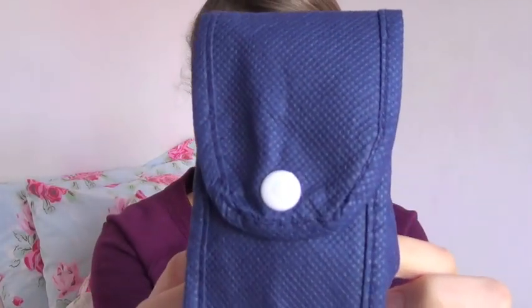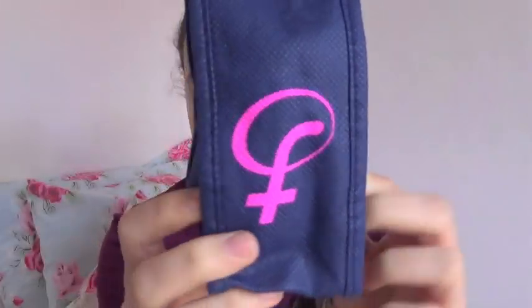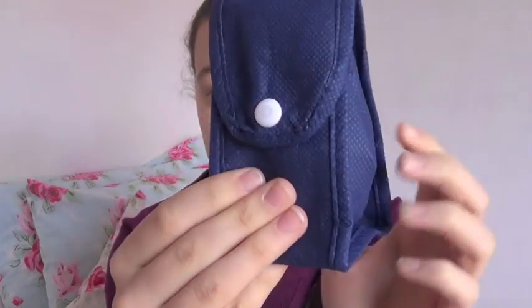This is the bag that it comes in. They actually send you two FemiCycles but because this is a sample cup they only sent me one.